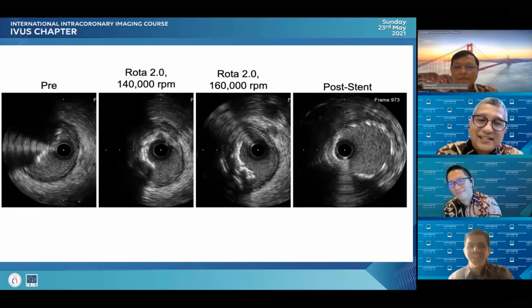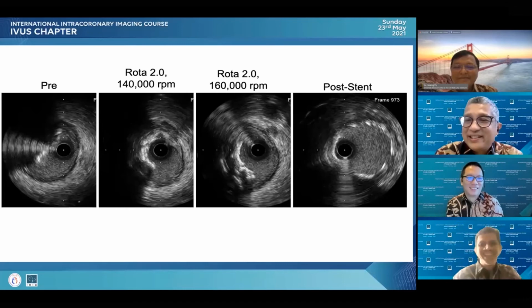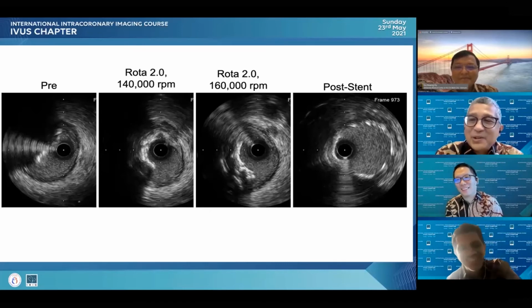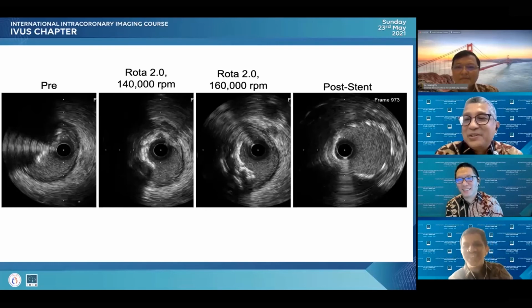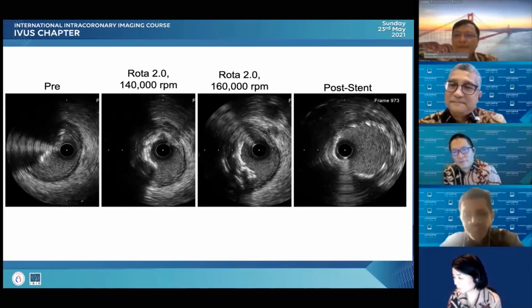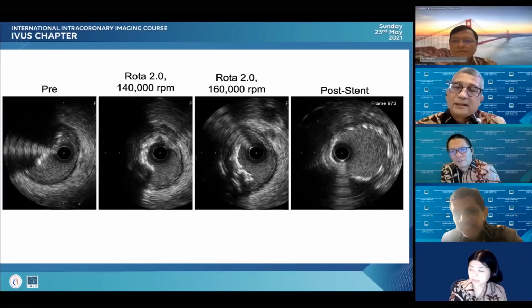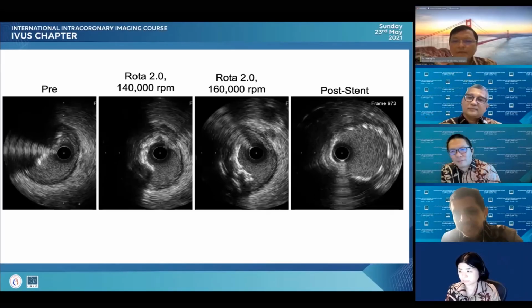Yeah, that's great. So it's comparing IVUS and OCT, in terms of knowing where your wire is. I don't know, Akiko, what do you think about that? I was in Dr. Xiaoyan Chang's lab, and he always does the IVUS after the crushing, before rewiring to the circumflex. He always checks.